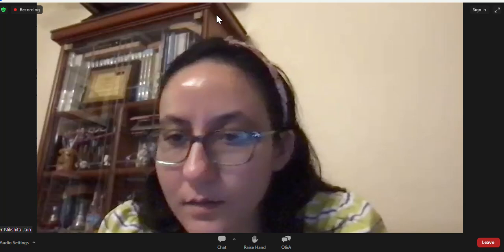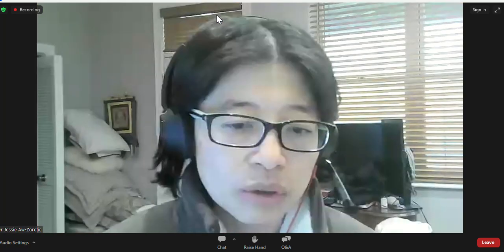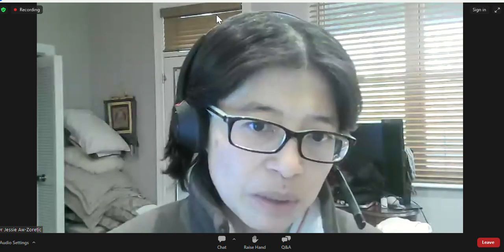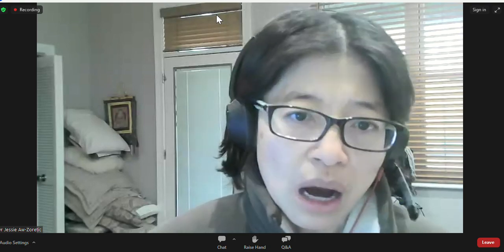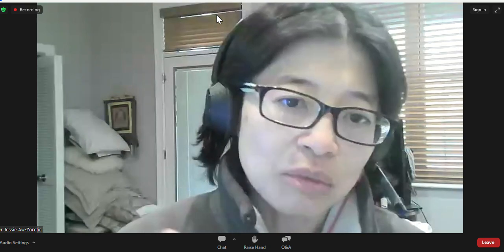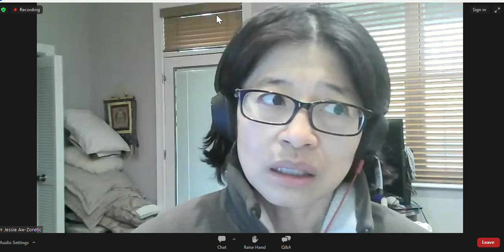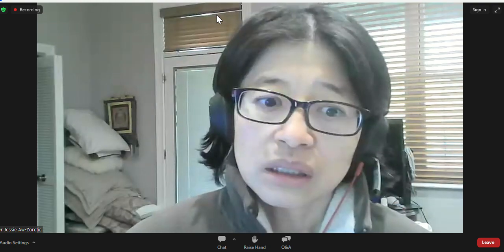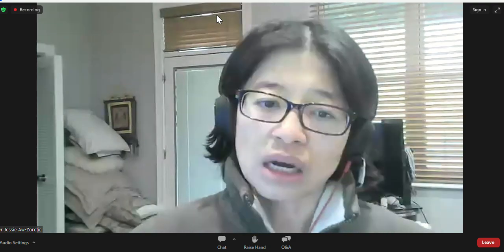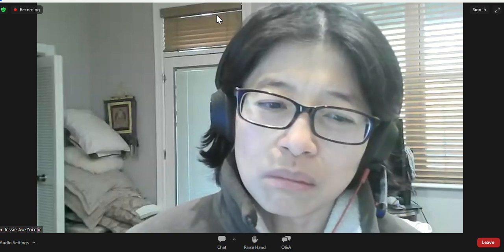Okay. I just saw a question about tracheoesophageal fistula. Yeah, we do image those for that. I try. That is one you definitely have to be at the scanner or with your tech. I'm trying to chase that view of the esophagus, and sometimes you can get it just by pure chance. The sagittal and the coronal, and then I try and get the tech to just image that chest. But sometimes you need the whole body to get more SNR.